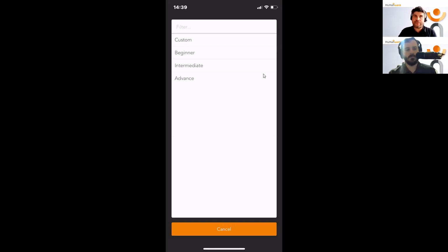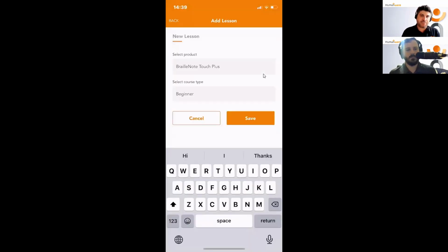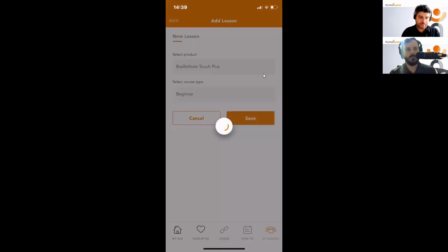Now, if for whatever reason you've got someone who just wants to learn all kinds of different stuff in one go, maybe it's the internet, emails, different types of lesson plans that you want to arrange, at that point I suggest you would select custom. And I'll come on to that because Peter is going to be having a custom lesson. But for Andrew, he's a beginner on the BrailleNote Touch. I'm going to select beginner and I'm going to click save.